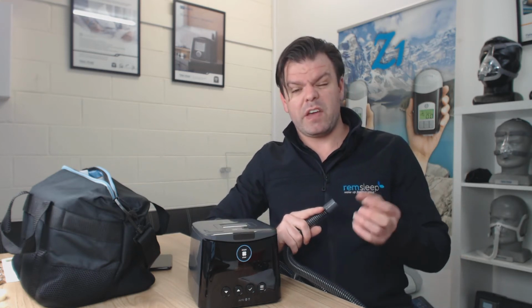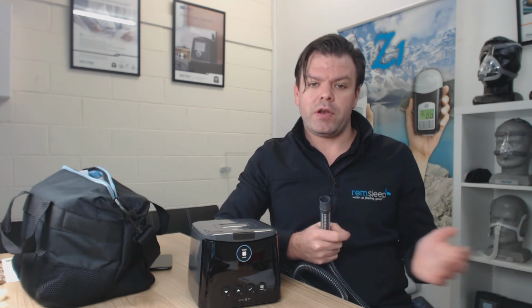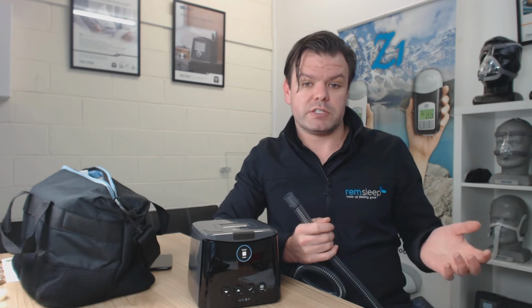You can look at your apnea-hypopnea index. You can look at your leak rates from your mask, and it'll also give you tips if something's not right. Say you're getting a whole lot of high leak warnings from the app. It'll then give you tips. You can check out videos on how to improve that. It really just keeps you informed as to what's going on with your data. For some people that might not be important, but for some people it'll be really handy just to be able to check maybe once a week and go, all right, this thing's doing its job, or if it's not, how do we fix it?